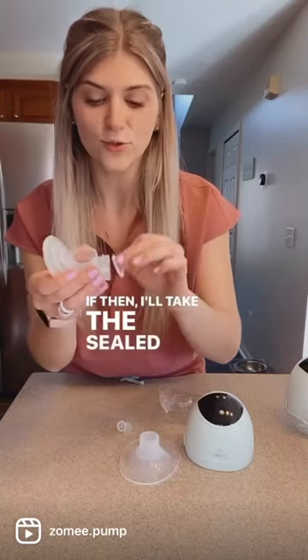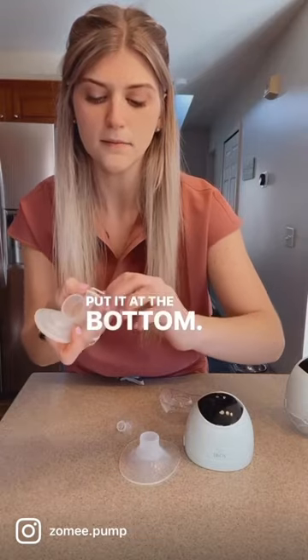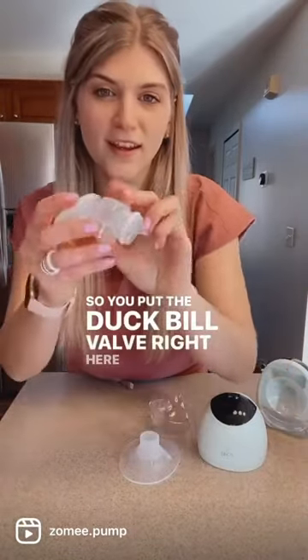Then take the sealed ring and put it at the bottom. Then put the duckbill valve right here at the bottom as well.